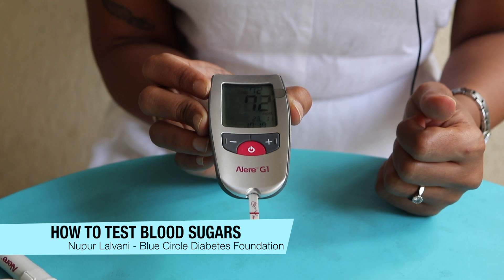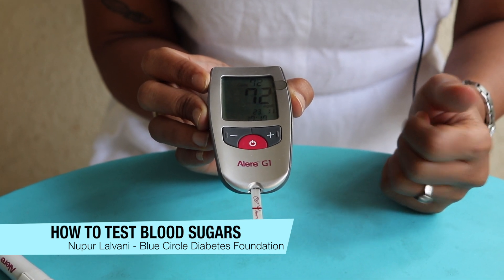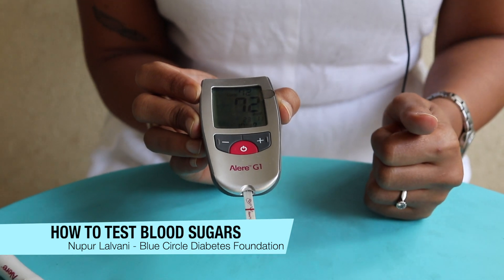My blood sugar is a steady 72 right now, and that's that. Thank you.